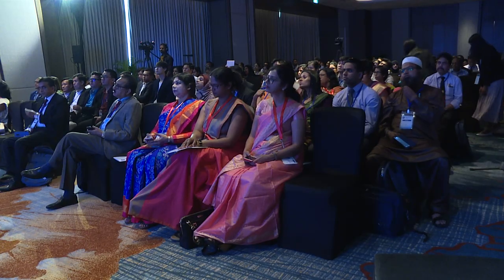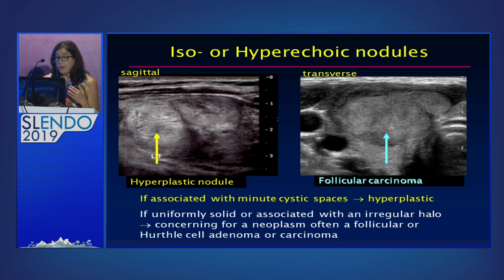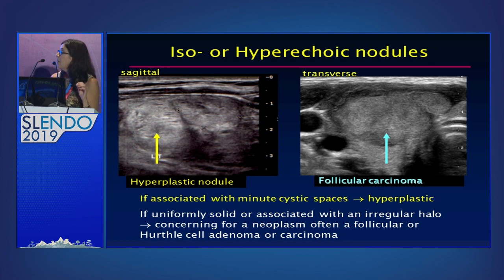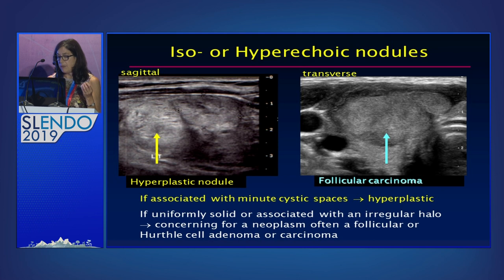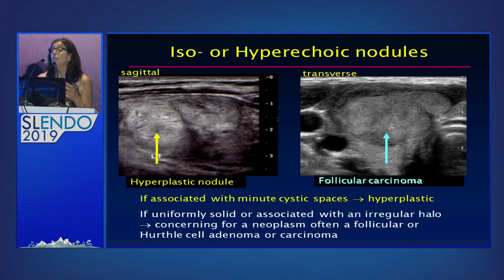These are all hypoechoic solid nodules. Now, this is the non-hypoechoic solid nodule. These are two nodules that are what we call iso or hyperechoic, because their gray is the same as the background thyroid or slightly brighter. But again, there are differences here. If you look at this nodule, you can see some small black areas in it, and that's cyst fluid — so it's a nodule that has some mixed cystic areas, whereas this one is homogeneously solid. Echogenicity and composition together are going to become important. If you have an iso or hyperechoic nodule with small cystic spaces, these are generally benign and often do not require aspiration, whereas the isoechoic but uniformly solid one — which also has a slightly irregular border — is aspirated.